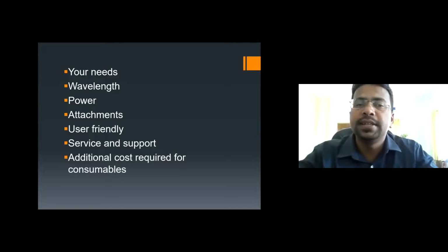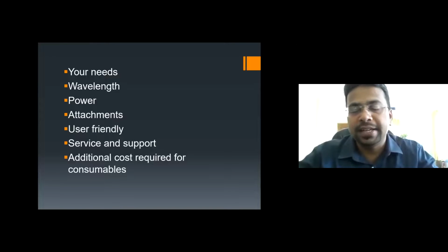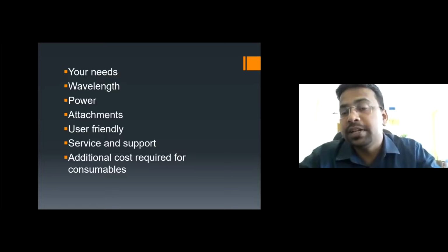It should be user friendly. The most important thing is service and support. If that person is giving proper servicing and support, then that laser is good. Okay, and additional cost required for the consumables.